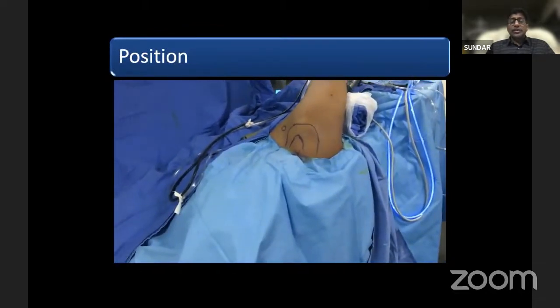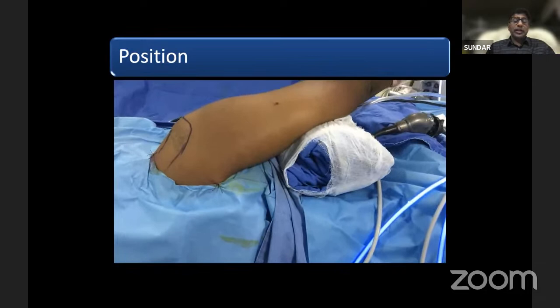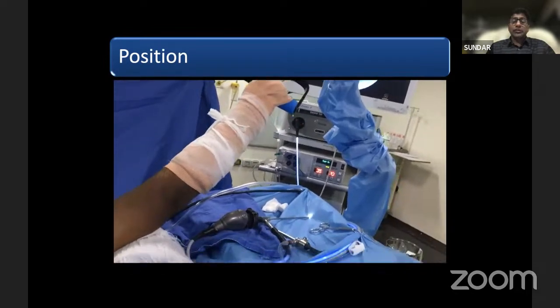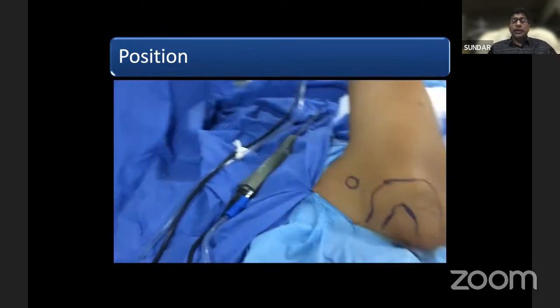You can see that this is from the head side where you stand and operate. And you can see that is how you operate from the posterior side. That is the head side where you operate from, your superior portal. This is how your traction helps you, 40 to 50 degrees of traction. And I keep the Mayo table at the foot end, and our staff helps you on that.